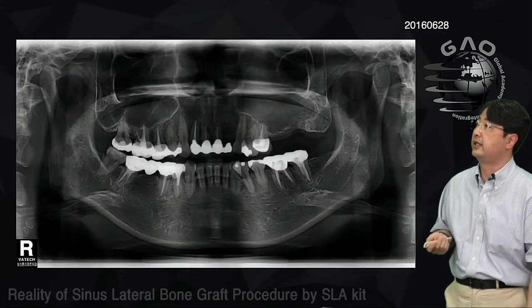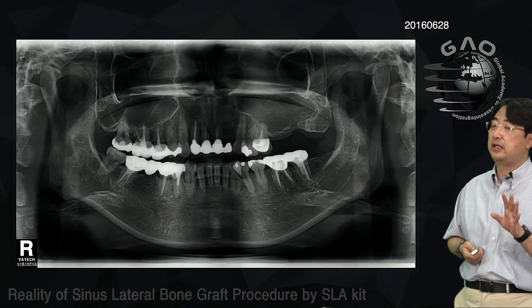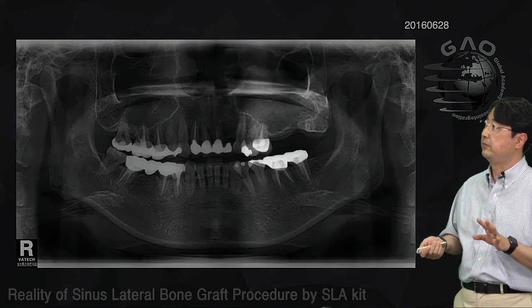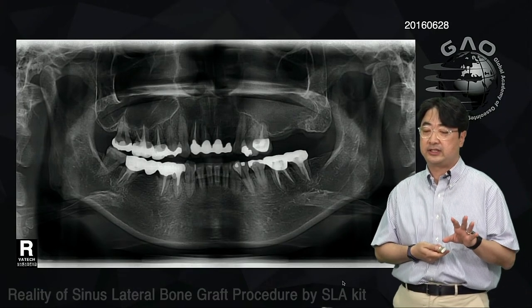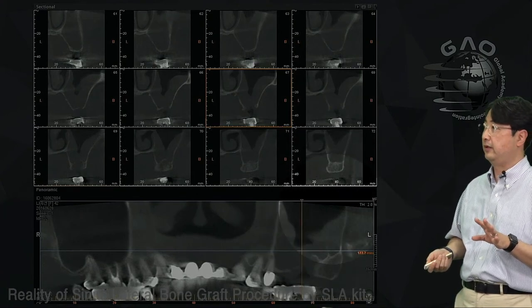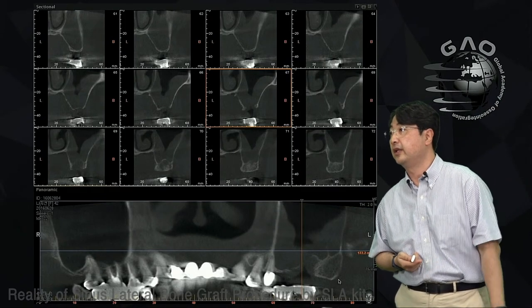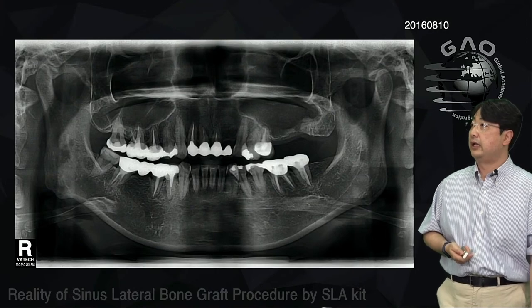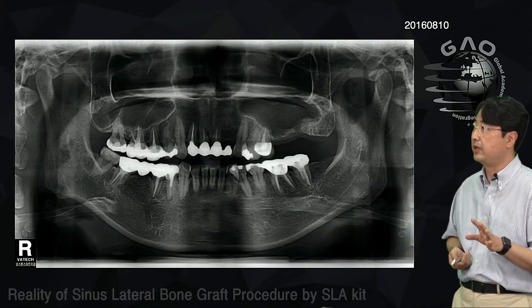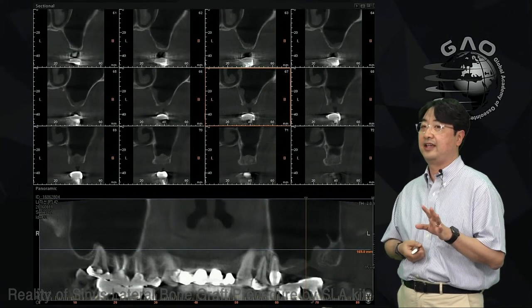Okay, so here is another case. This patient needs some bone graft and sinus graft for the left posterior maxilla, right? But here you see haziness in the left maxillary sinus. From the CT scan, you can see the thickening of the sinus membrane on the left side. So I told her to go to the ENT doctor, and she had medication for a couple of months. Then she came back. As you see, there is no membrane thickening anymore, right?